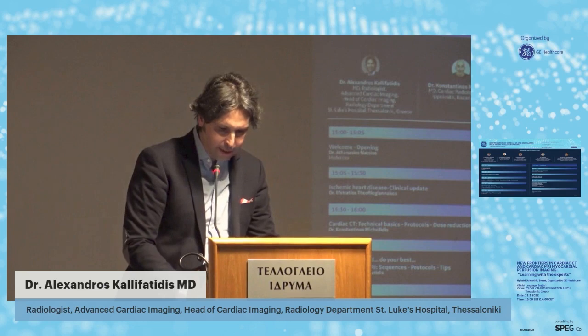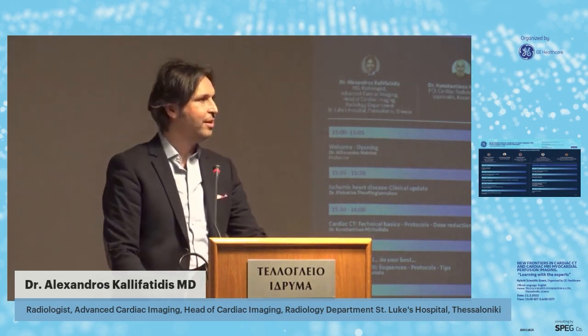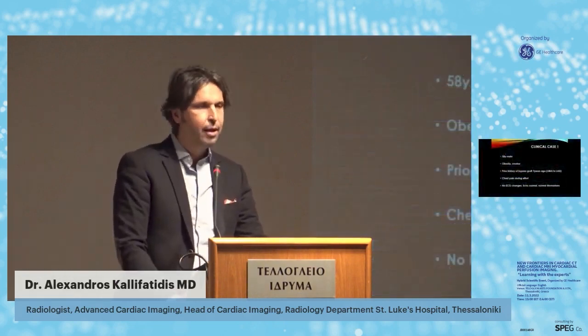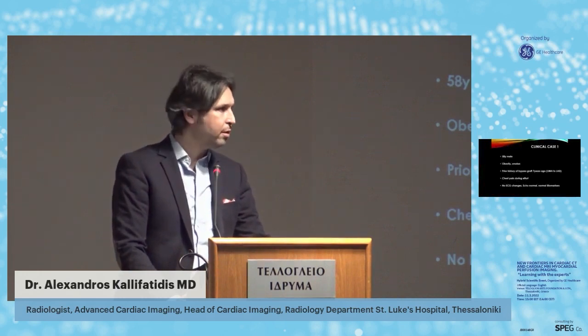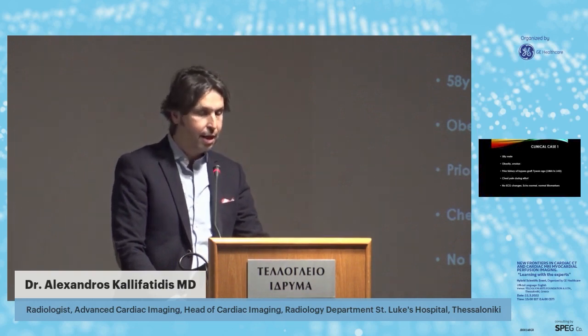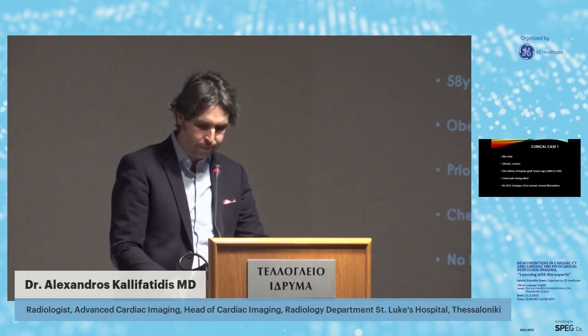Let's see, now this is a case from a few years ago. We scanned it together with Ilias, a good colleague. A 58-year-old male with obesity, a smoker, and a prior history of bypass graft, who presented with chest pain during effort with no ECG changes. His echocardiography was normal, with normal biomarkers.